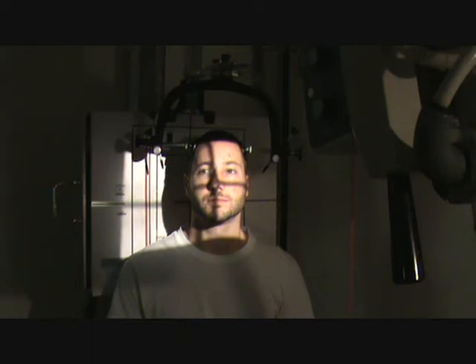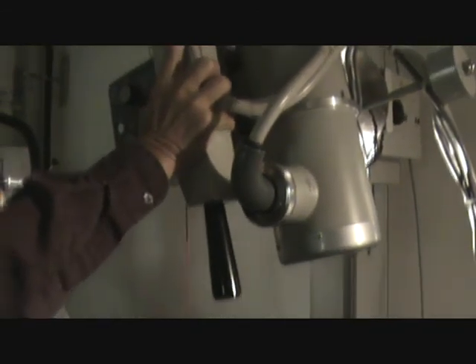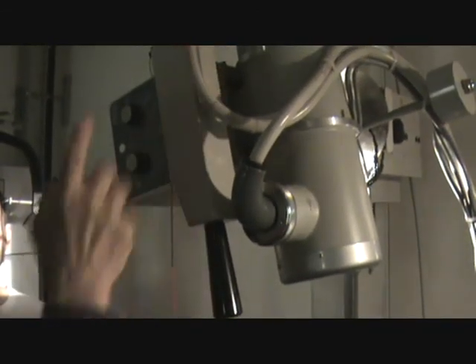We make an exposure and come back out. We take the cassette out and place a new cassette labeled 'stereo left,' because now we're going to shift the tube all the way back toward the left side of the bucky an equal distance, and take another shot. Once that shot is taken, we have two cassettes — one stereo right, one stereo left — and those two go into a stereo view box to view in 3D.